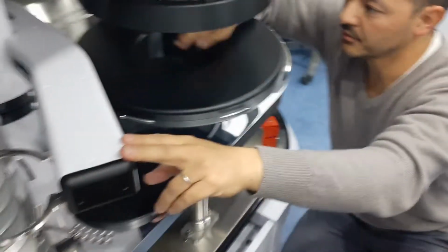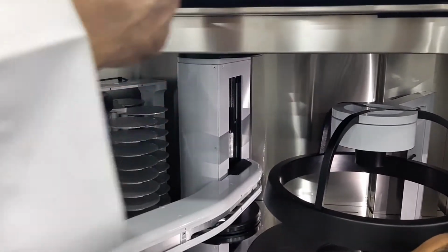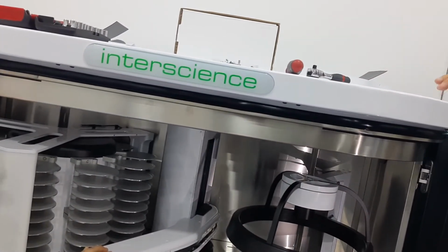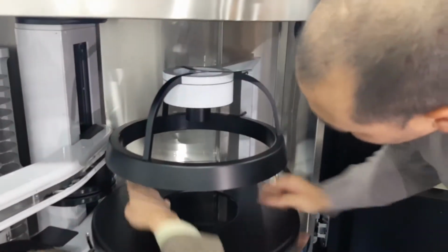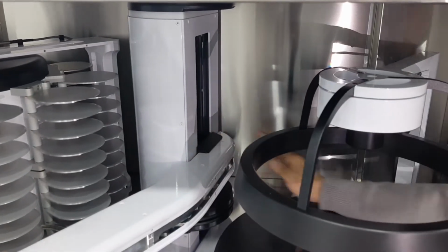Oh yeah, so that's the spot. Put some grease there. And also, I have to put some grease there. Here you have access to the 3 greasing spots. You can see the 3 yellow. Those 3 points of greasing are to grease the Z-axis. There are tubes going inside up to there to grease the ball screw.